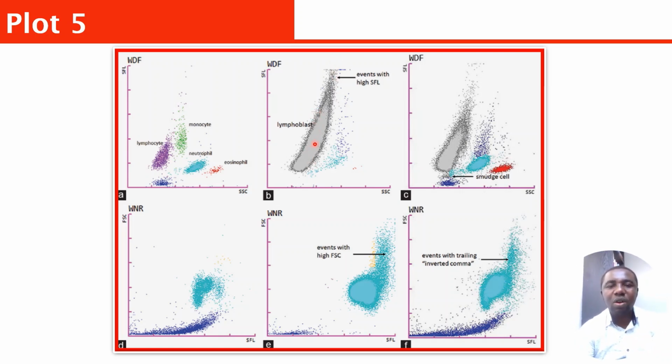And not just that it shifted up, you are going to see that it is now grayish in color, okay? Very clear grayish in color. When you see something like this, start suspecting lymphoblast. Very, very important. So when you see something like this, it's already showing you there's a problem, okay? Then you investigate further, okay? Now, the same thing is applicable here.